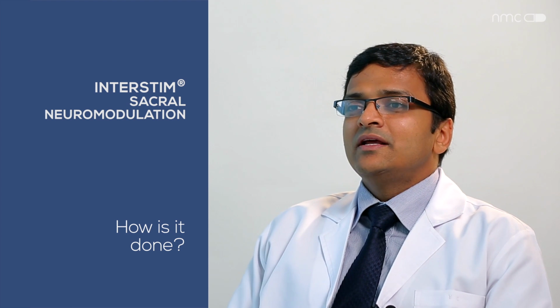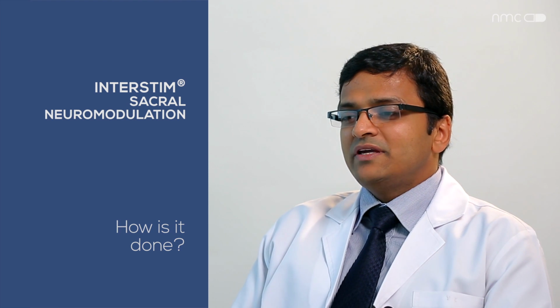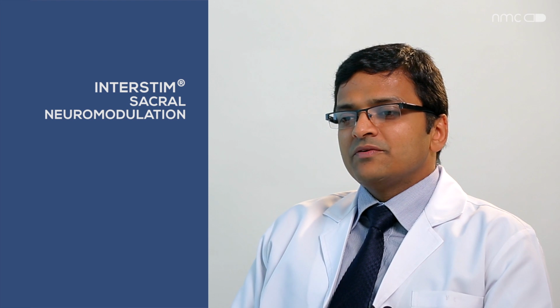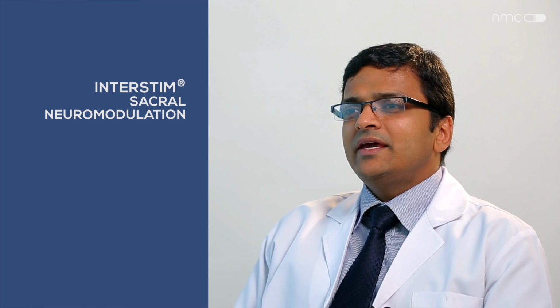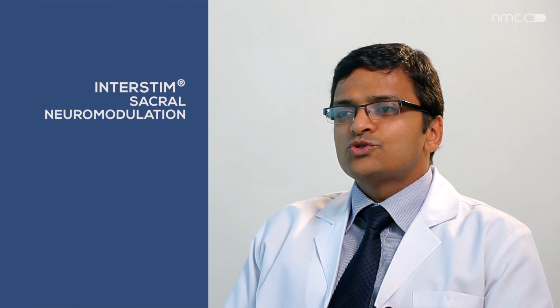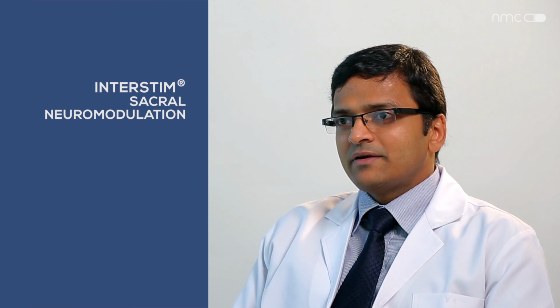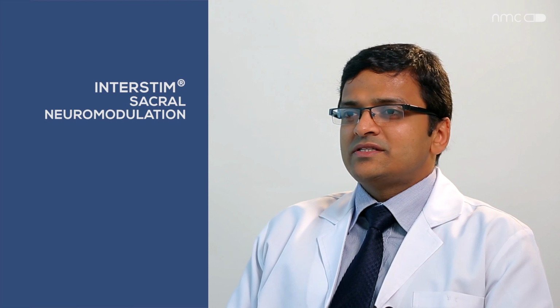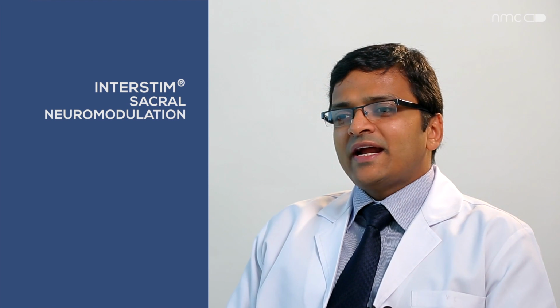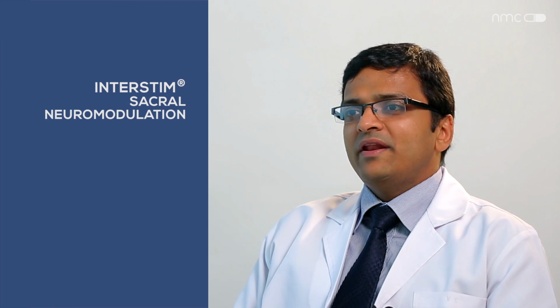In fact, it is done under what we call local anesthesia when the patient is awake, and we give only numbing injections. It is done in 3 stages. In the first stage, we place an electronic lead close to one of the nerves, and then attach that to an external pacemaker, and the patient goes home with this contraption. Then the pacemaker is activated and the patient is told to feel the benefit or no benefit.